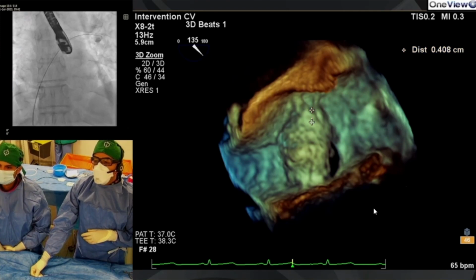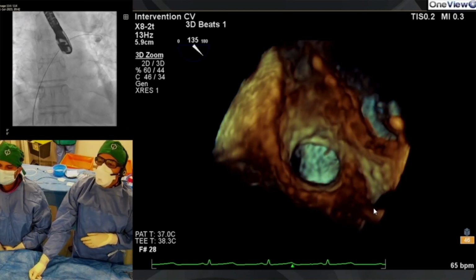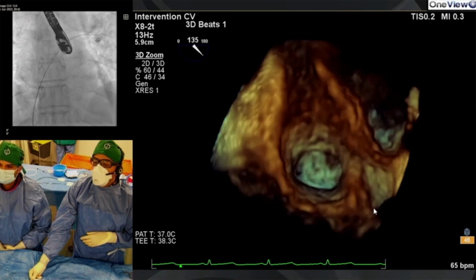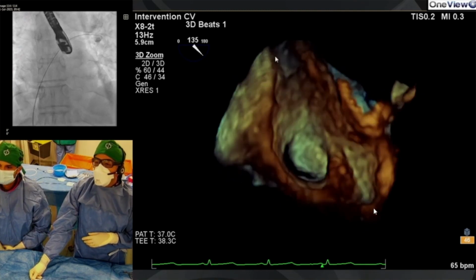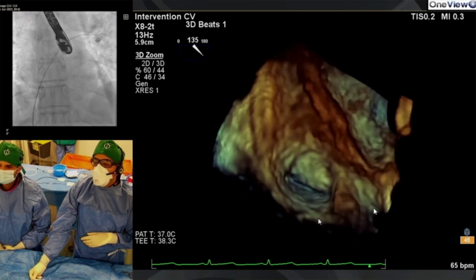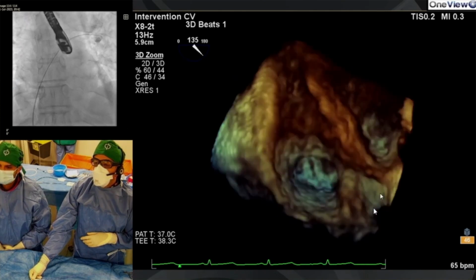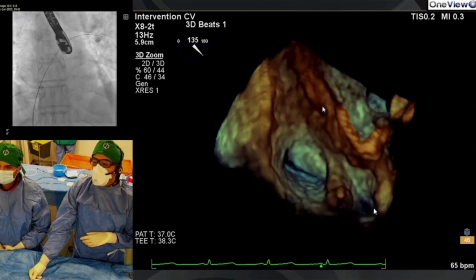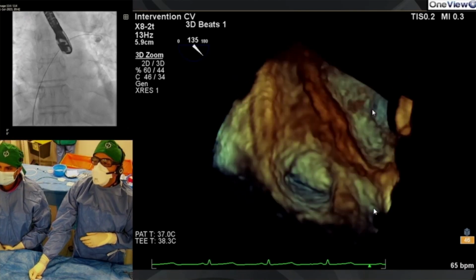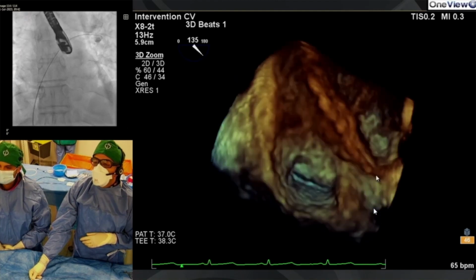But what is more complicated now is if I look at the other side, this is the right atrial view. I'm going to turn the gains down a little bit and let this image play. So again, just to get landmarks, here you've got the SVC coming in at the top here at the back. You have all of this is the IVC orifice, and also inferior but anterior is your coronary sinus. You can see your aortic root, ascending aorta coming in here. There's the root. You can see the valve cusp. This is the non-coronary cusp. A bit of the left is coming in at the back.